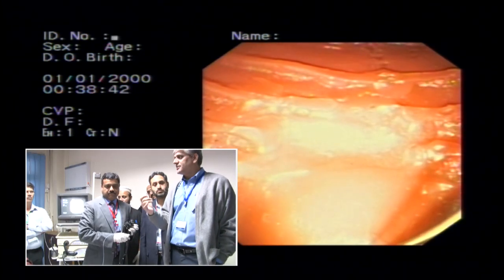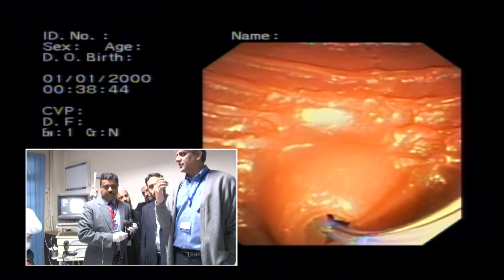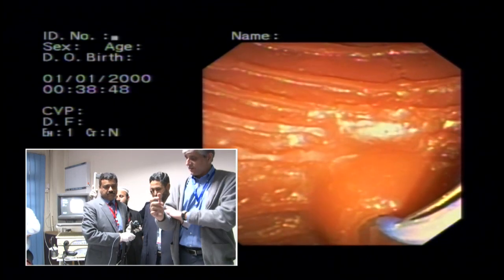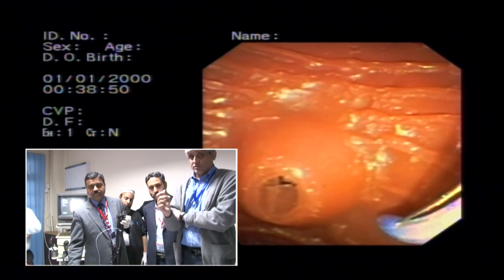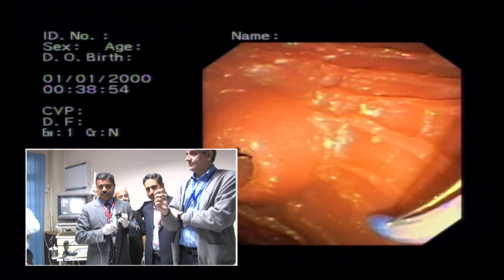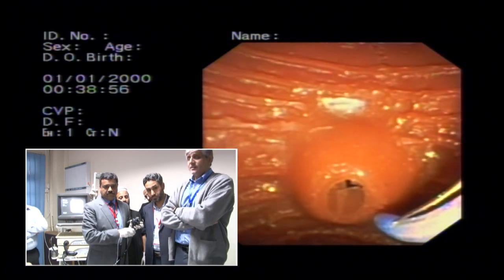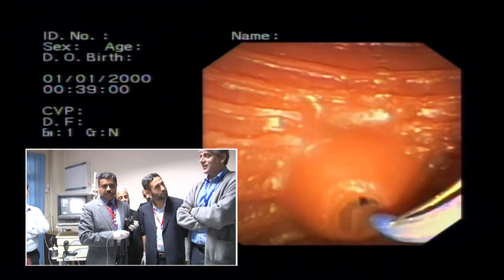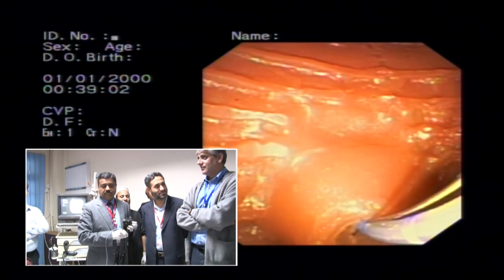And that's basically because once you're in the right position and comfortable position, you keep that position. Sometimes in difficult cases it hurts because your hand is literally like this and it doesn't move. So you need to be like Vakar was saying, once you're in the right position, stop breathing.